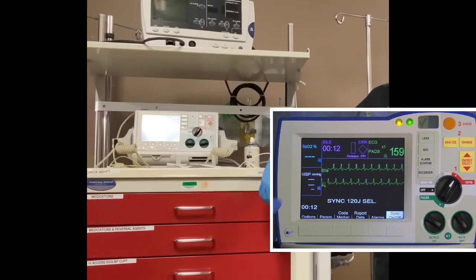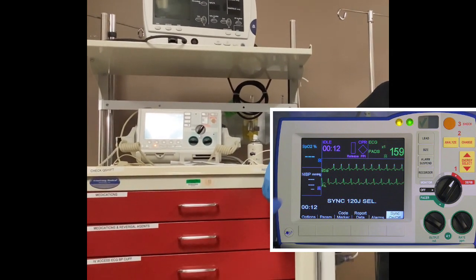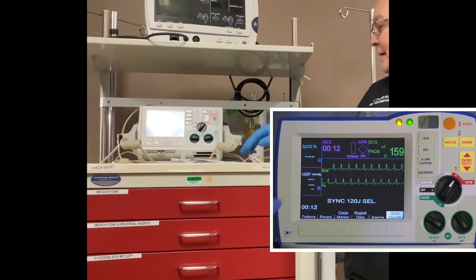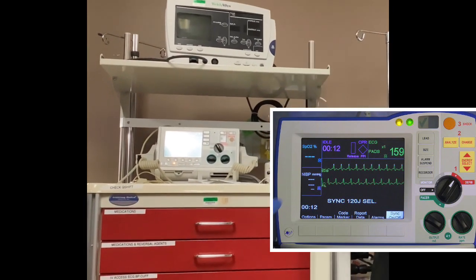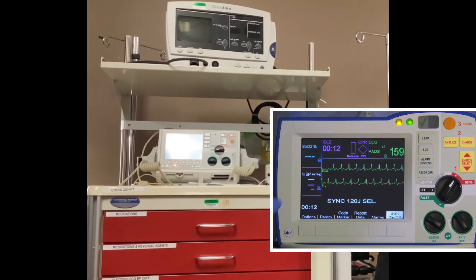Defibrillation we do for a patient without a pulse and nothing to sync to. Does that make sense? Do we not use the little paddles anymore? Well, we can, they're right here. Do hospitals still use them, or do you just use the pads? No, you use them. That's how you get the shock delivered. Oh, we thought it was just the pads. No, you put those on there. Oh, okay.